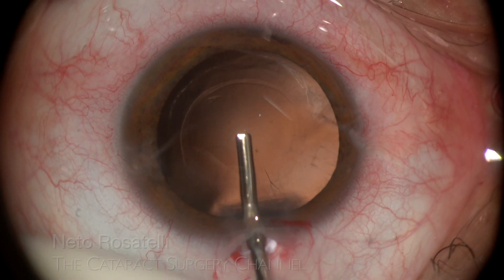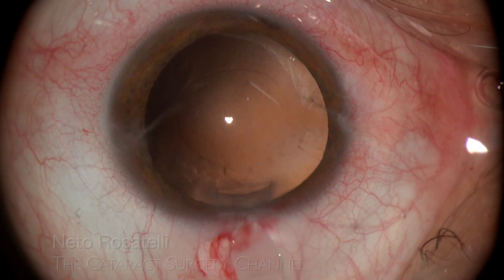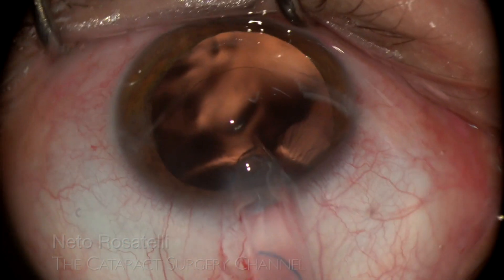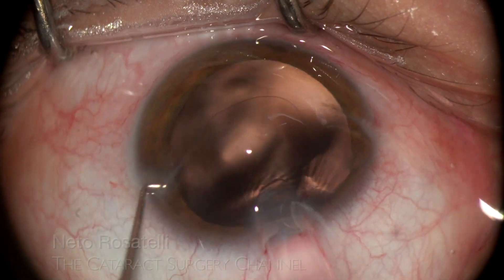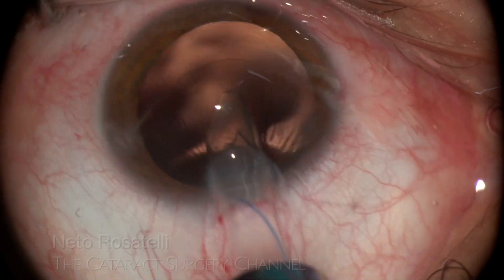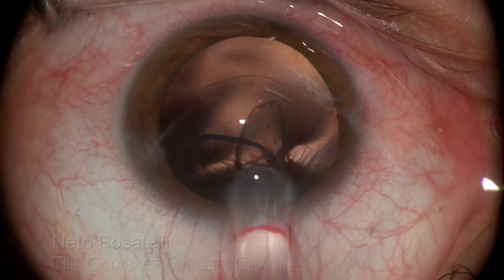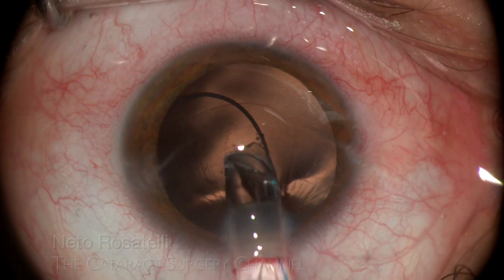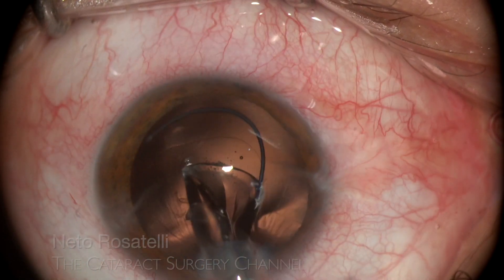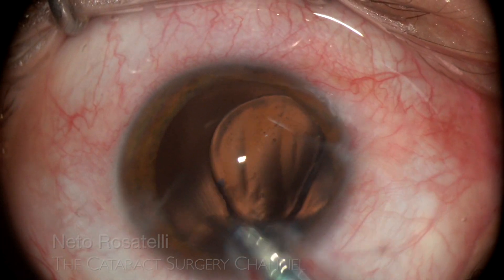A little OVD overfilling prior to IOL implantation is beneficial in these loose-bag cases. The elected IOL in this case is a three-piece hydrophobic acrylic one. Its rigid haptics are more able to withstand possible capsular contraction and offer various good options of IOL fixation should the need arise now or in the future. A capsular tension ring would be an excellent option here to better distribute forces throughout the zonules, but was not available. Nevertheless, zonular compromise due to trauma seldom progresses with time, so a stable situation is expected.